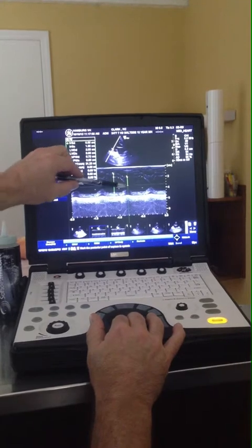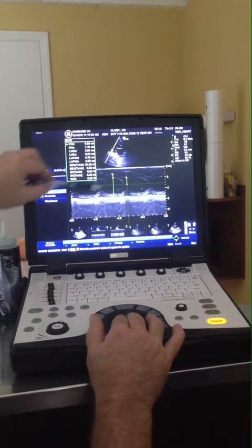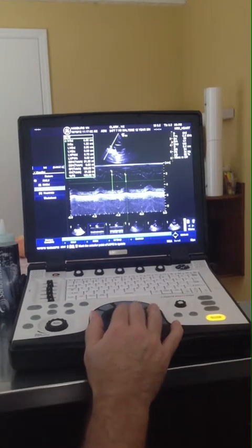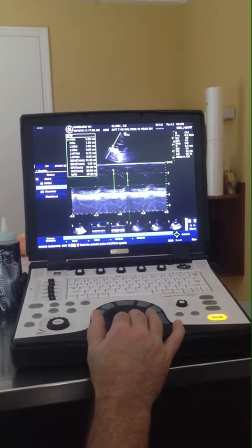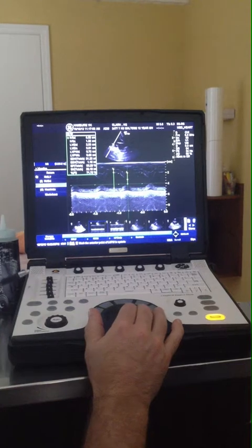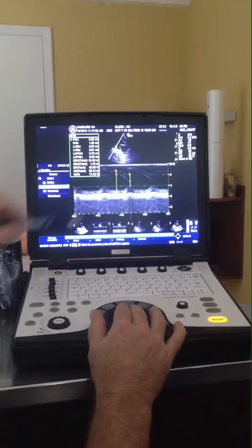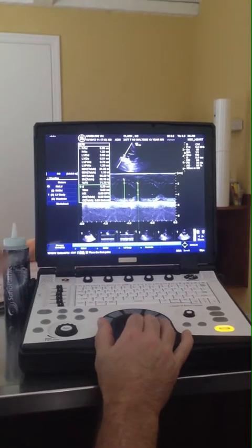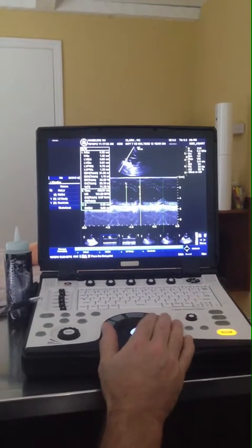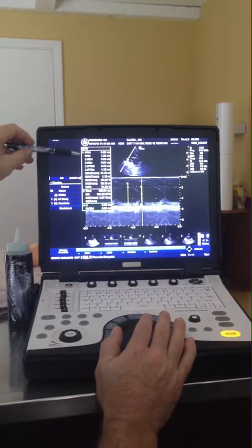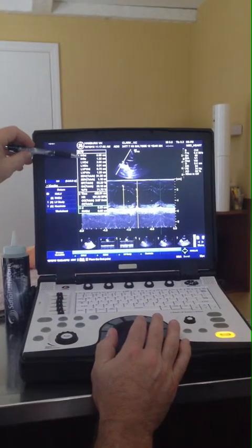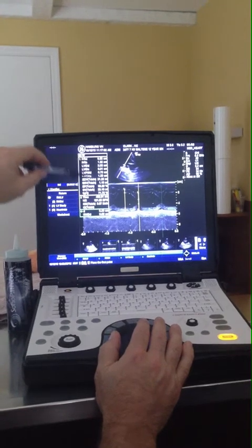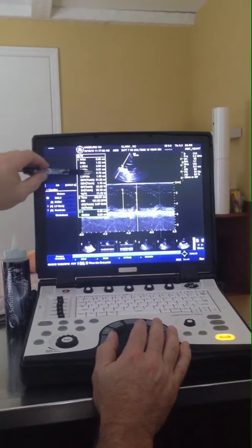The peak kind of falls out here, so I find where the peak is going to be on the other one and the prior one by the horizontal line, and use that to come down to the internal diameter in systole — which is obviously less than the internal diameter in diastole — and then the free wall in systole, then peak to peak for heart rate. I double-check that IVSD and FWD should be about the same: 0.58 and 0.72.